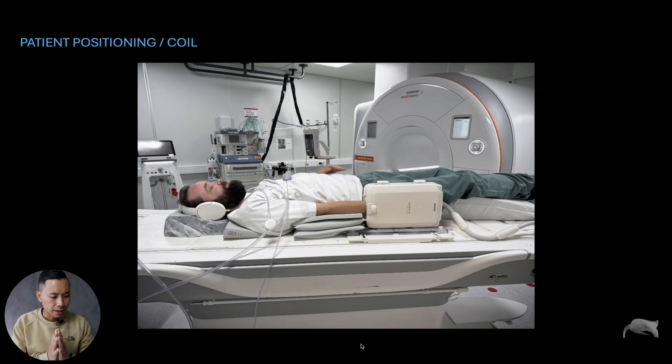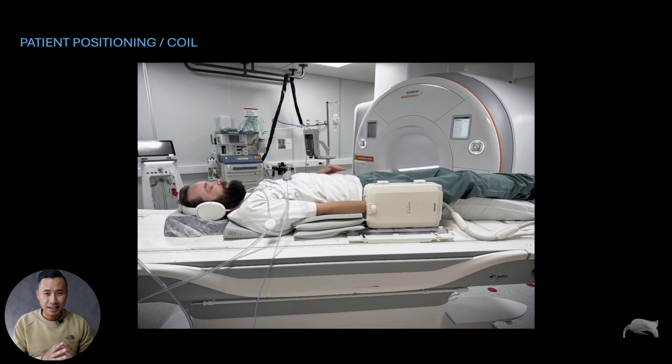In this case I'm using a dedicated hand wrist coil. Even though you're using a different coil or Superman positioning, the things I'm going to show you should be the same. This is how we usually do it — lying on the back, feet first, arm extended — which is most comfortable, but it's also challenging if the patient is big, due to fat saturation offset and the imaging. The newer scanners are much better compared to before.